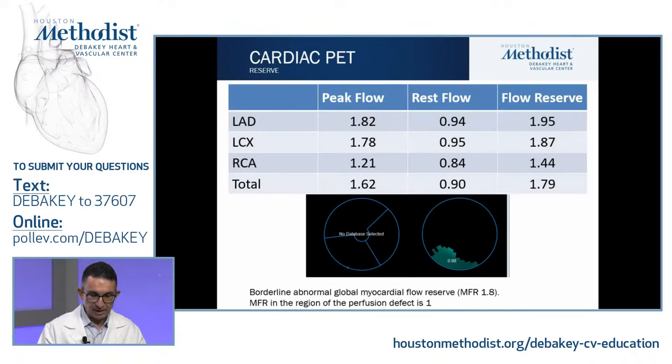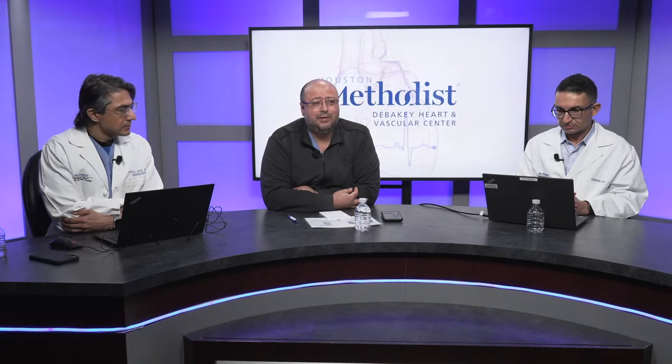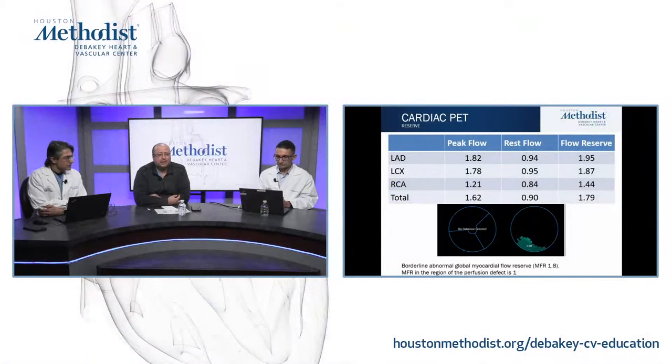In terms of risk, we know the atherosclerotic burden is the most potent predictor for this patient, but what about adding the predictor of peak myocardial blood flow? This is a very important aspect, and I think we need to emphasize that what will determine the long-term outcome of these patients is the atherosclerotic burden. Yes, there is a focal problem in the RCA, most likely, and we will see that later. But in the long term, this guy has a lot of atherosclerotic burden.